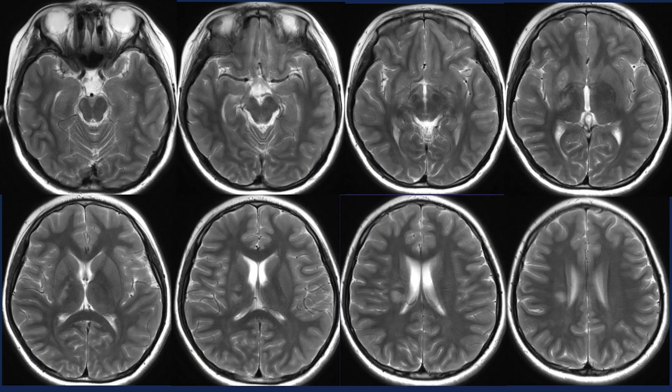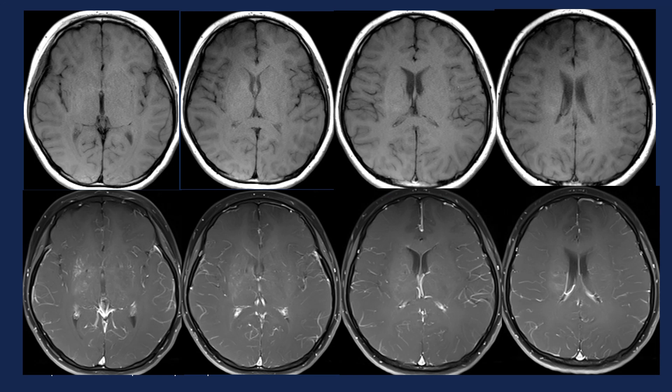An MRI was performed and these are the T2-weighted images taken across the area of interest. There is an ill-defined T2 hyper-intense lesion in the right lentiform nucleus and the thalamus, extending across the posterior limb of the internal capsule and superiorly into the corona radiata. There is no mass effect. Note also that there is reduction in volume of the right cerebral peduncle and slight hyper-intensity suggestive of Wallerian degeneration. On T1-weighted images the lesion is not evident, and on post-contrast scans there is mild enhancement of the lesion in the lentiform nucleus and thalamus.